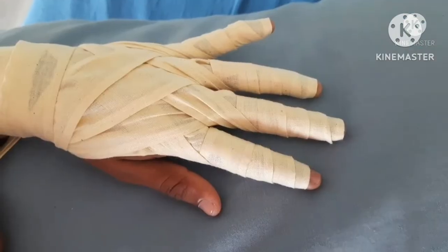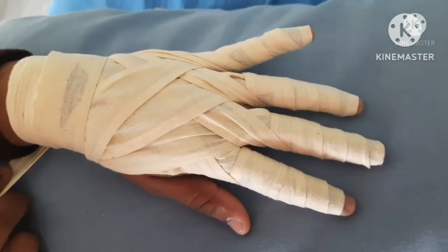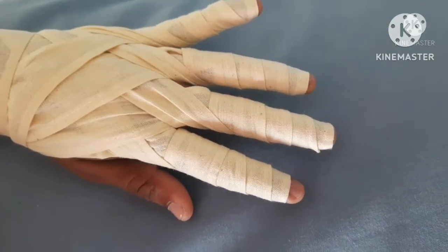According to the injured area, we can cover the fingers. Terminate with two circular turns around the wrist and secure it with tape.